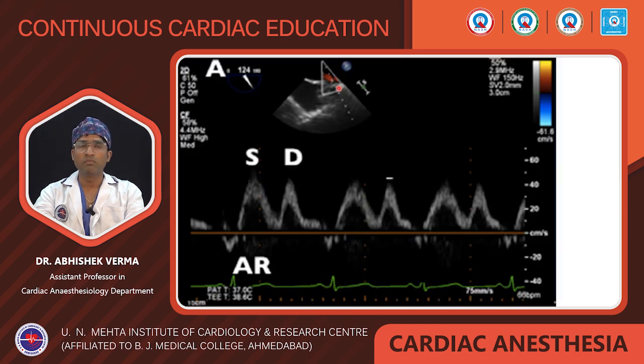Here, if we put the pulse wave Doppler 1 centimeter inside the pulmonary vein, you can find the systolic S wave, the diastolic D wave, and then the atrial reversal. This is during the systolic phase, and this is during the diastolic phase.